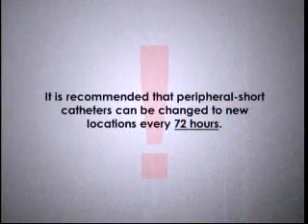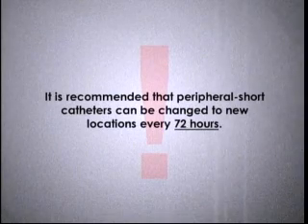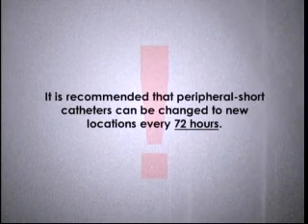Site rotation should be considered in site selection assessments. It is recommended that peripheral short catheters be changed to new locations every 72 hours. That means you should not only consider the current status of available vascular access, but consider where the next potential site location may be if continuation of the therapy is required.